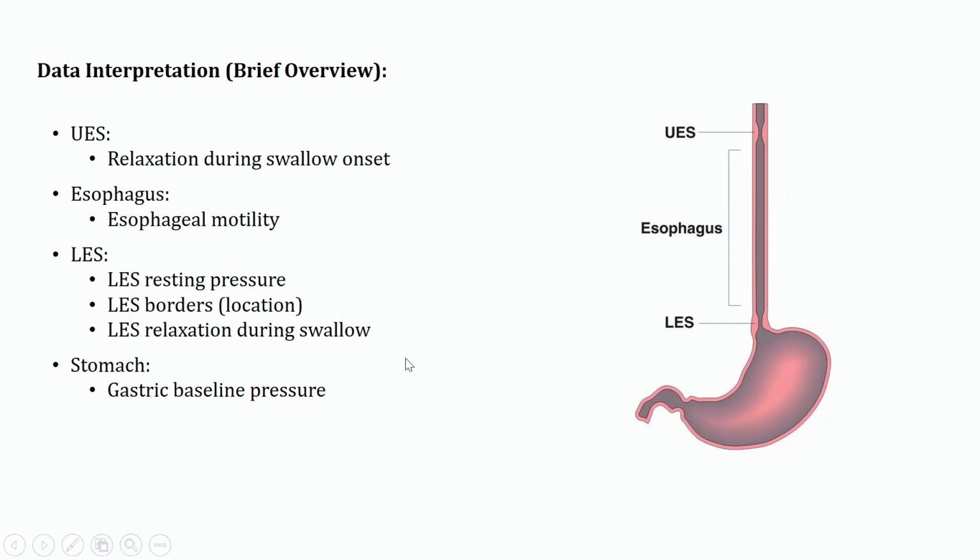Okay. This is very nice. I think it's a very nice photo that really illustrates a lot to anybody who wants to have an idea about what it is that we're looking at. So it's really like you're looking at two sphincters and two organs here. Yes. They're all just as important in order to interpret the results. So this is great, Basil. Perfect.